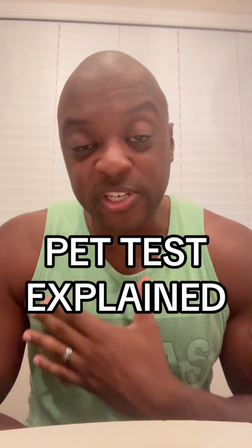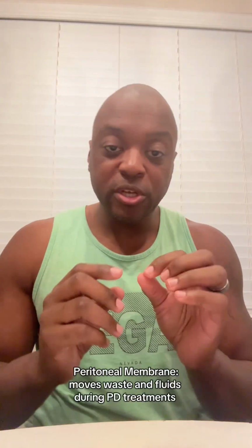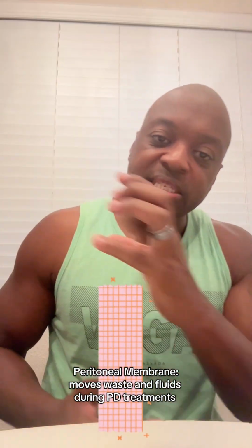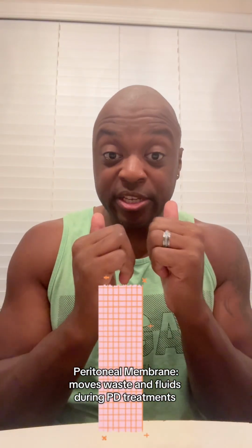PD nurse asked me to explain the PET test in a simple way. So here we go. First, let's start with the peritoneal cavity. The peritoneal membrane inside this cavity, when you put the dialysate fluid in, it removes toxins and excess fluid from the body. That's its job, and it's great.